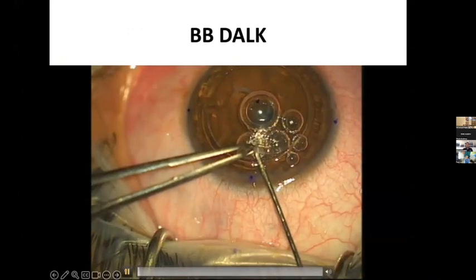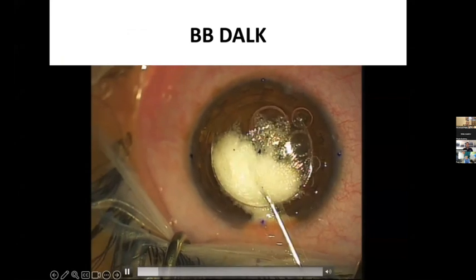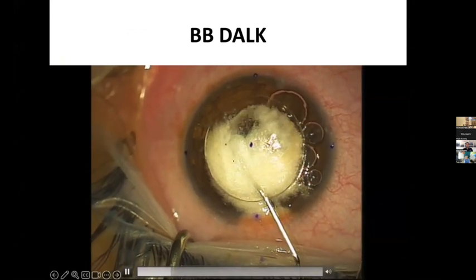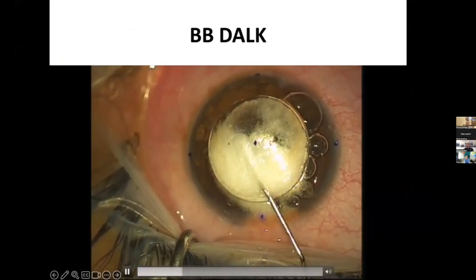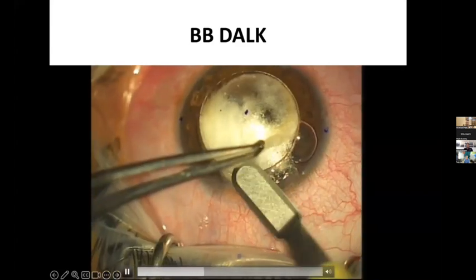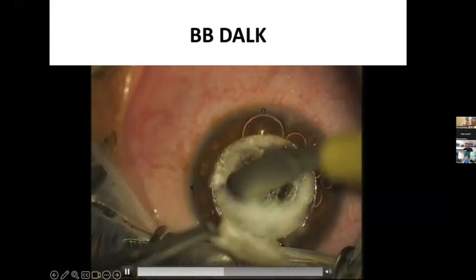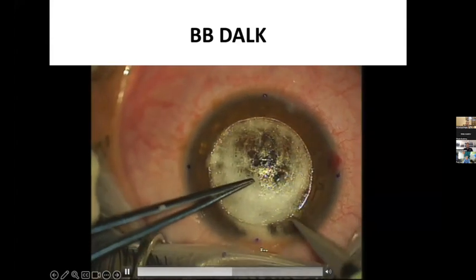This is a short video showing the classical big bubble. After partial trephination, we inject air in the anterior chamber. There's some whitening and then a circular silvery opacity filling the corneal stroma and displacing the air in the anterior chamber to the periphery.